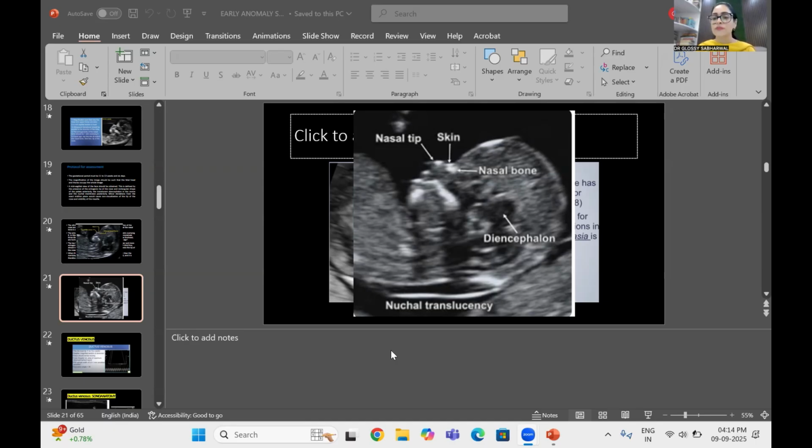you have done all of that for 15, 20 minutes, half an hour, then it is important that you do a transvaginal ultrasound. Sometimes the fetus is continuously in the prone position, and when you do a transvaginal ultrasound, the orientation changes and the nuchal translucency is clearly seen, and in fact it is better seen. It can be uncomfortable for the patient, but at the same time, you can always try that if the fetus is not moving.